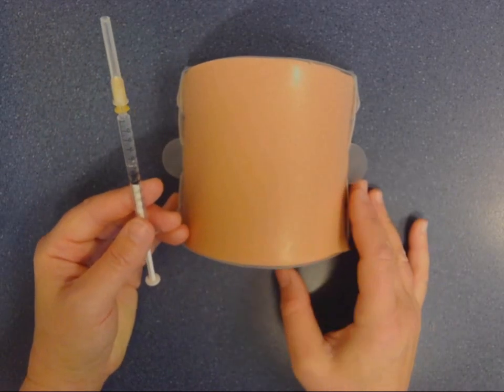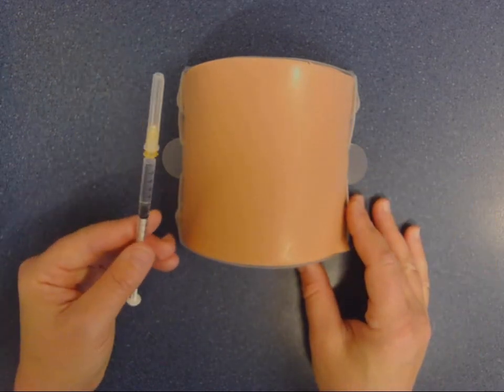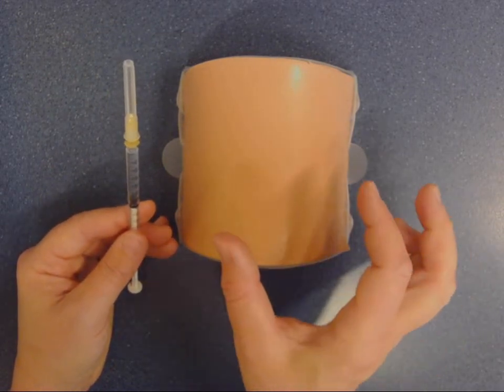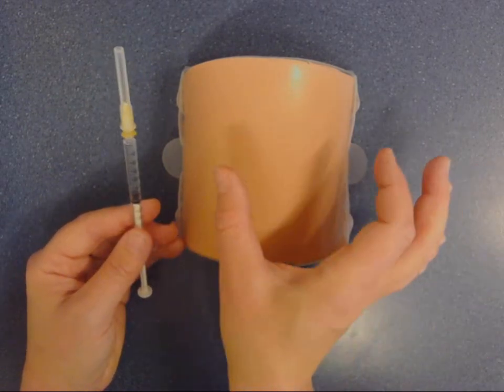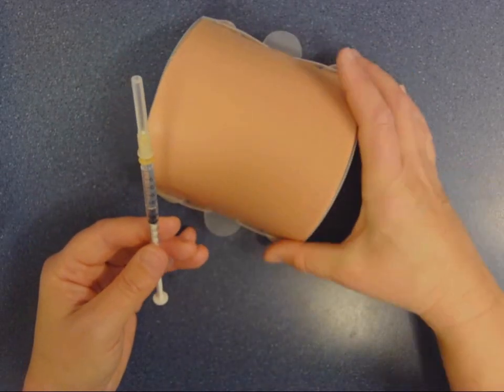My skin is clean. My patient's skin is clean. So I'm left handed, so I'm going to inject with my left hand. And I'm going to use my non-dominant hand with my thumb and my index finger to pinch the skin.